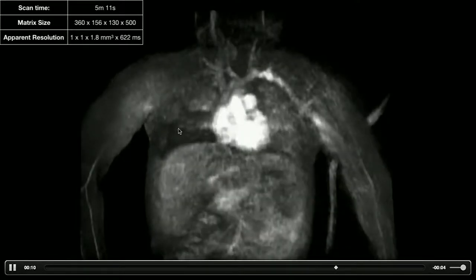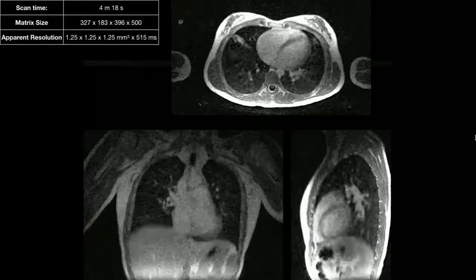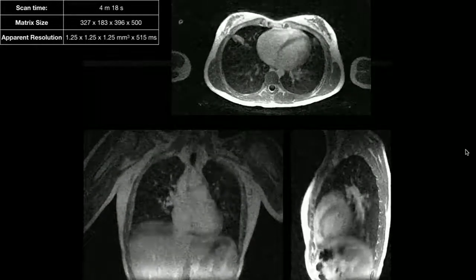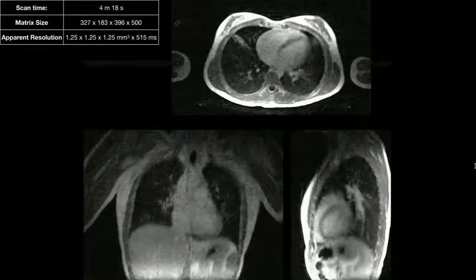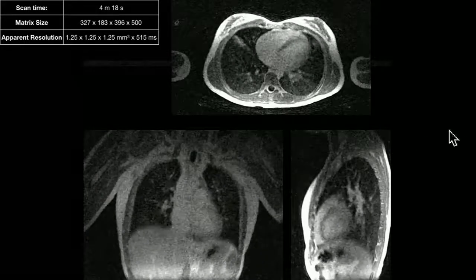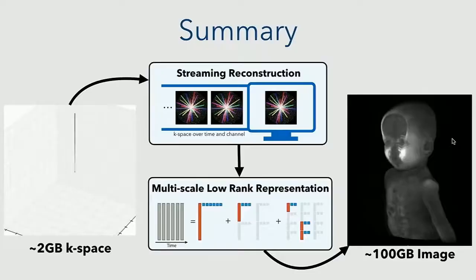And so going inside, you can look at the contrast enhancement, and again, huge motion. Right, and so this is DC. And remember the navigator I've shown earlier. Here's the high resolution reconstruction of it. As you can see, we're able to see a lot of the transient dynamics here. Now, granted, there's still more improvement we can make to deal with the noise and so on, but we're already able to see a lot of the dynamics here.